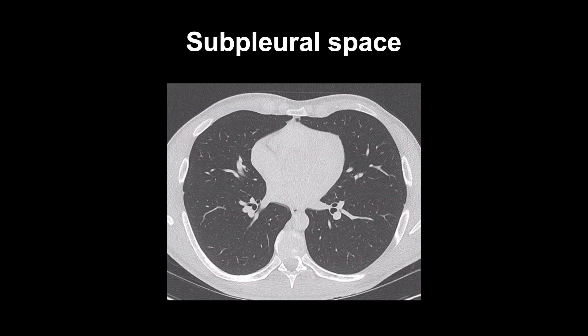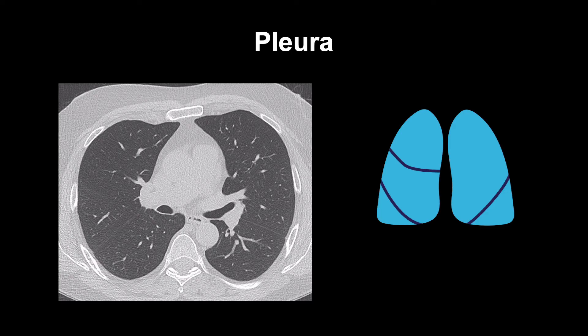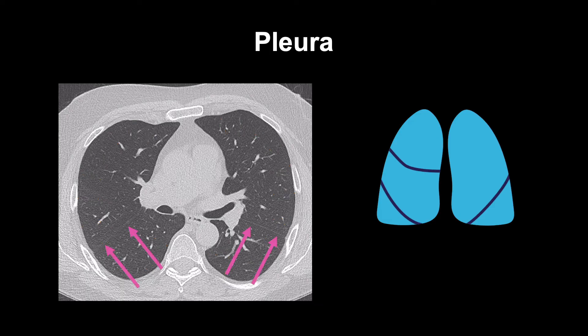No lung markings can be seen within 1 cm of the pleura, meaning there are no visible airways, vasculature, or interstitium in the subpleural space. The pleura is found at the lung edges and should be smooth, uniform, and sharply defined. Since normal pleura is less than 1 mm thick, it's usually not visible unless you are looking along a fissure. Only about 20% of people have all three complete fissures — the right oblique, right horizontal, and left oblique. Commonly, fissures are incomplete, or accessory fissures exist.